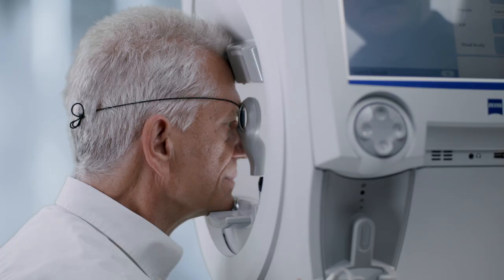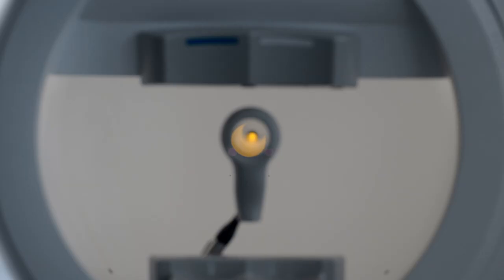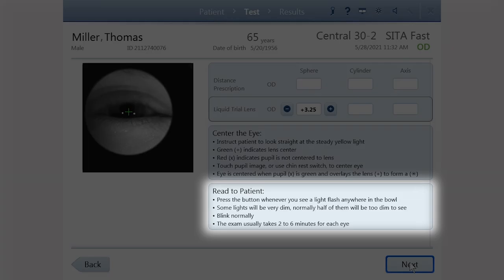This is a good time to confirm that the patient can clearly see the fixation light. If not, make the necessary trial lens adjustments. The screen has instructions for you to use to inform the patient on how to take the test. Use these or your own version of the instructions to inform the patient at this time.